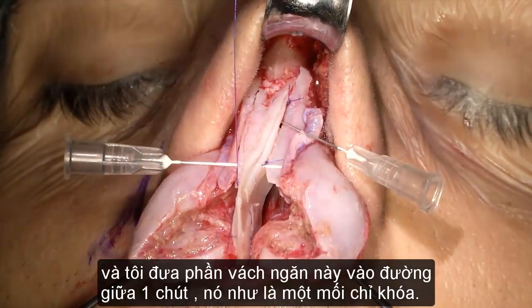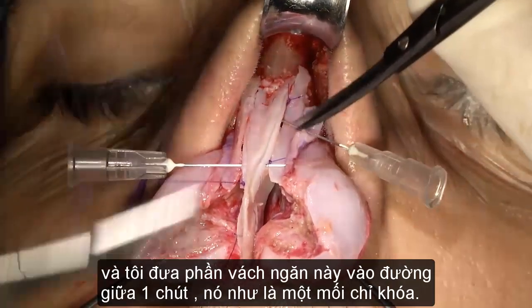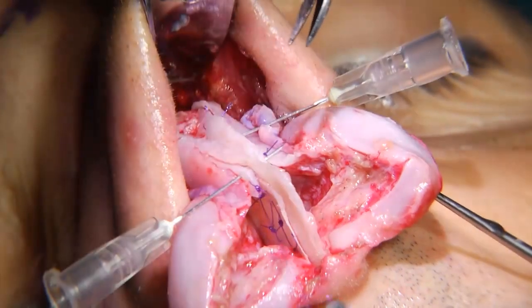And I'm bringing this septum a little bit more in the midline because it's almost a clocking suture in a way.